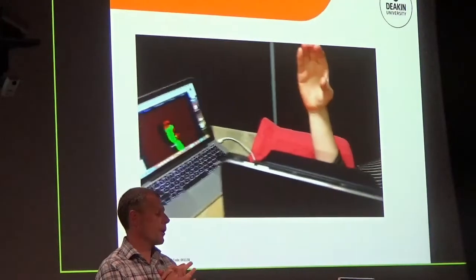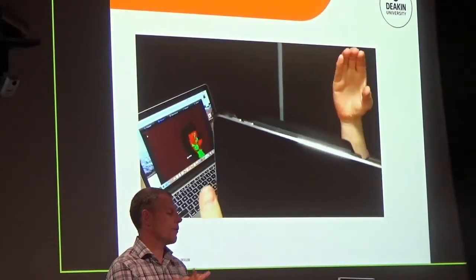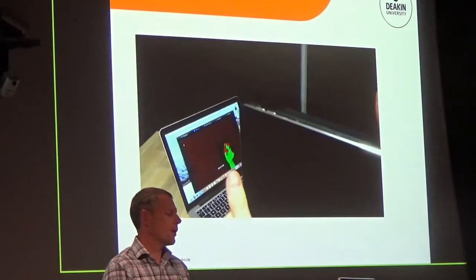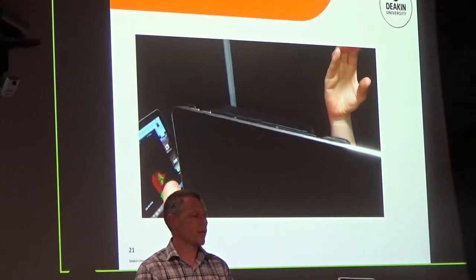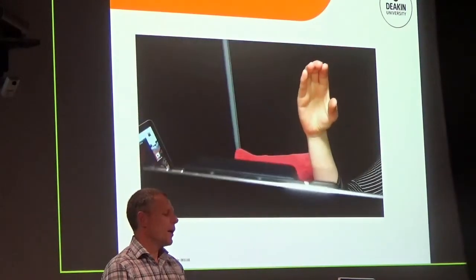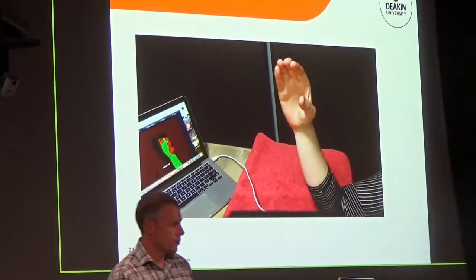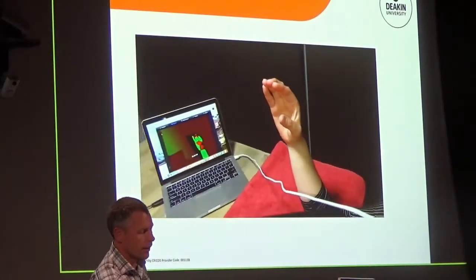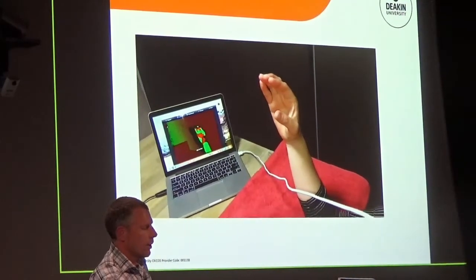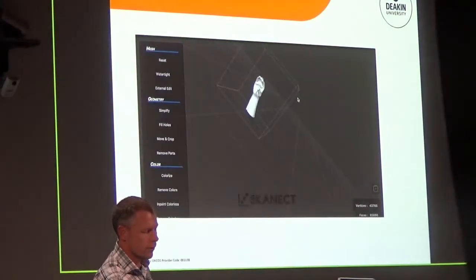Basically, you can see on the screen that the hand on the image has got a green colour or a red colour. Green means it's in focus, red means it's not so in focus. So I'll get in the way of that screen in a second. But basically, if you're asking the person to not move and you slowly work your way around the limb, or position of whatever it might be, you can scan these and you get a fairly good take of the use of it, not too much, no contact with the person, and so forth.